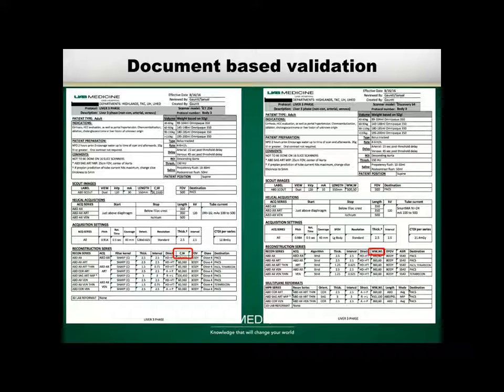Final thing that's kind of subtle, maybe I'm just being anal retentive, but you'll notice I've got my lookup table information here listed as C, W. On the Philips scanners, they describe their lookup tables as center and width. On GE scanners, it's window width and window level. Actually, it's not just a matter of the terminology, but the order in which they're presented on the scanner changes. If you don't account for that when you're setting up the protocols, you've added a possible stumbling block for someone setting it up. I have seen this happen where people enter the window setting where they should have put the level, and the level where they should have put the window, because this was not clear on the form.